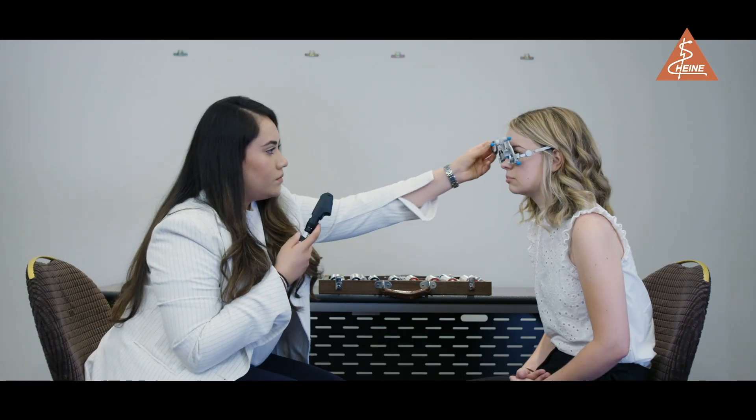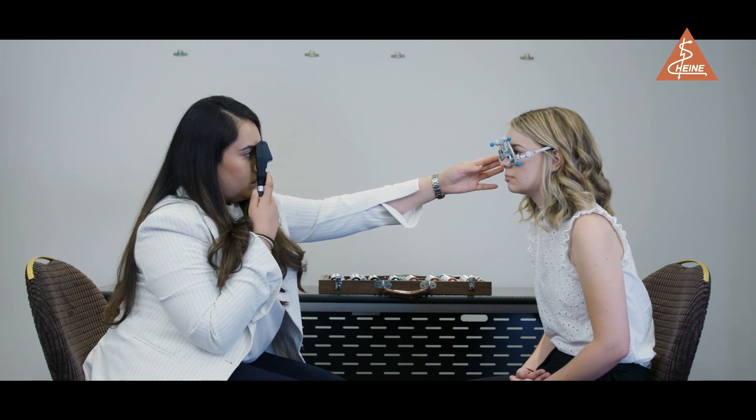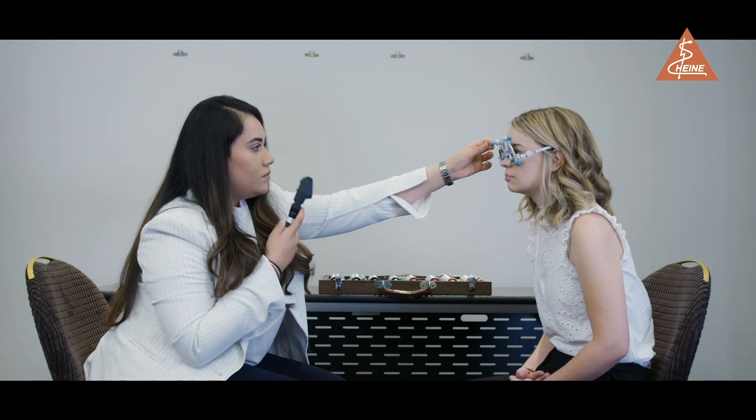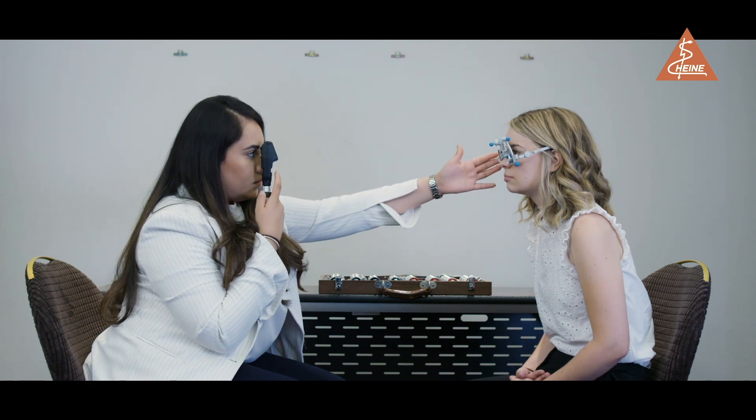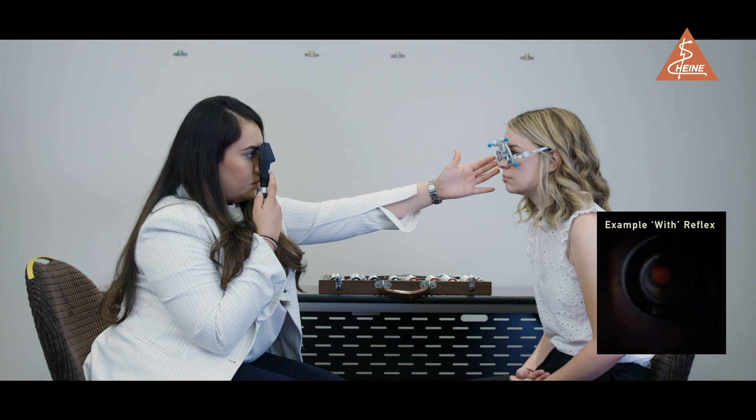Spherical lenses are used first before moving on to the cylindrical or astigmatic component. Once you have established the most positive meridian, if you notice a with reflex — i.e. the reflex moves in the same direction as the light — add positive lenses until there is no movement of the reflex.